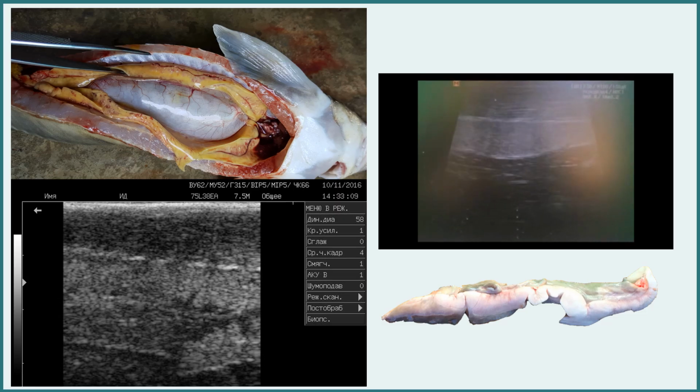From an economic point of view, the first division of fish by sex is advisable when most of the fish have reached marketable weight. Usually, by this point, the gonads are well formed, and from this point we will begin our training. How to understand whether you succeeded to capture a gonad. The image of the gonads as well as other internal organs on sonograms is in principle similar to their appearance. And if the gonad has a heterogeneous structure, we observe this heterogeneity on the sonogram.